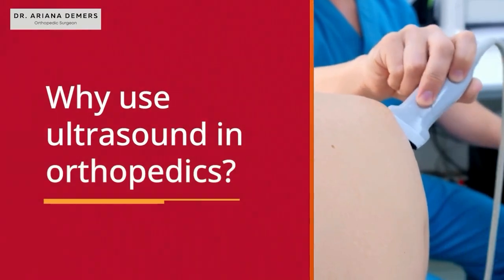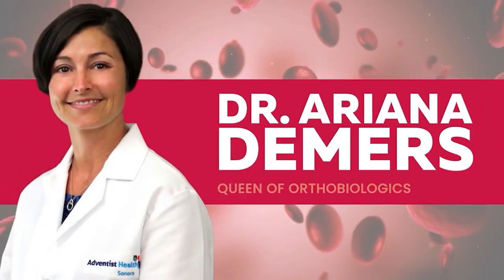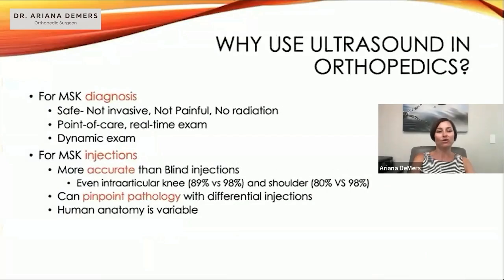So why use ultrasound in orthopedics? Two reasons. One is for diagnosis. It's safe, it's non-invasive, there's no radiation, and you can use it at point of care in real time with a dynamic exam. So you can watch things moving in real time. Additionally, for MSK injections, you are quite a bit more accurate than blind injections.